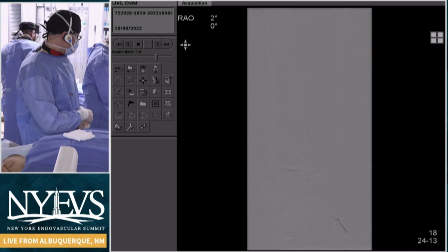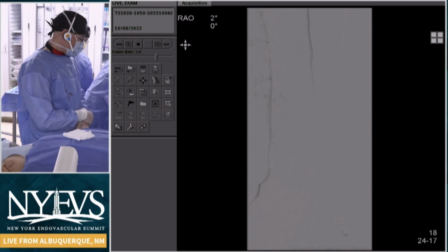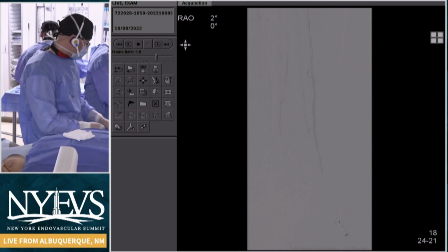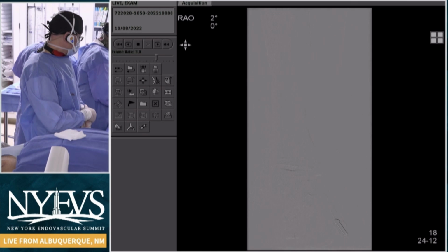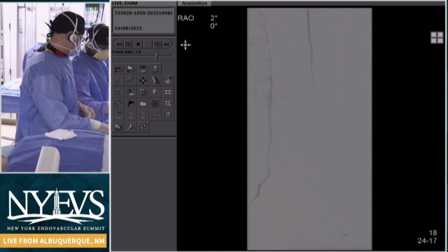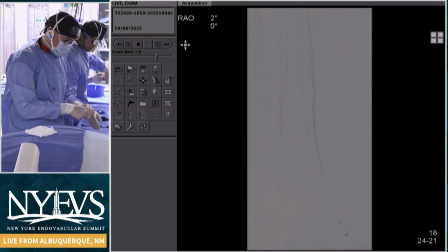Oh, generally, atherectomy should be the good option when there is so much amount of calcium, because we saw on the IVUS, this is definitely a circumferential distribution, 360 degrees. So there is no way using any other device to debulk the lesion. And at that point, obviously, you have to perform a better angioplasty. You can use a larger balloon and keep inflated for a longer period, and see also the outflow distally if there is enough to keep the vessel patent.